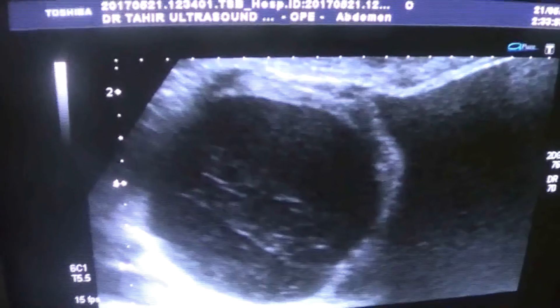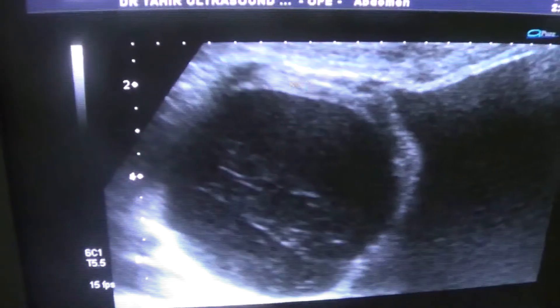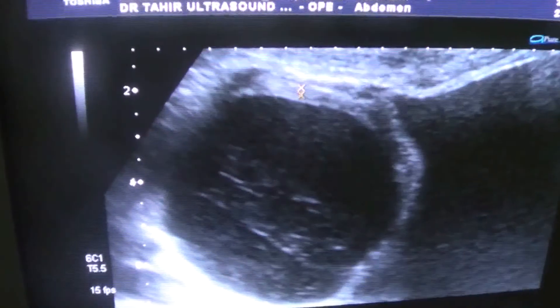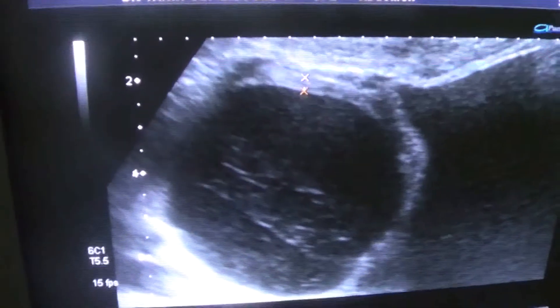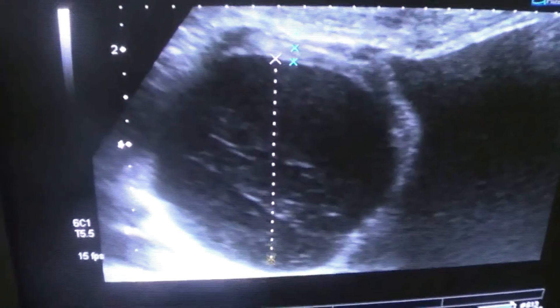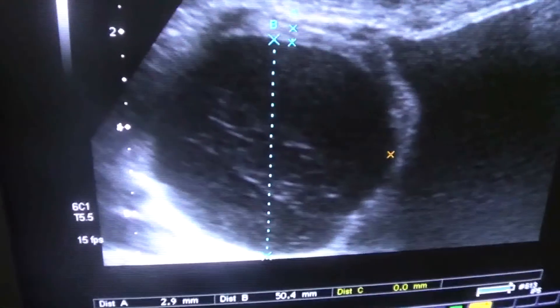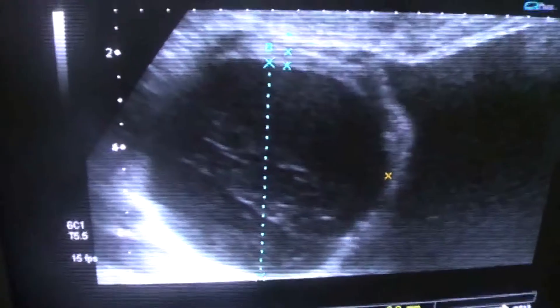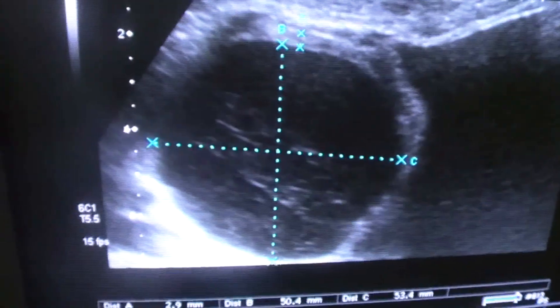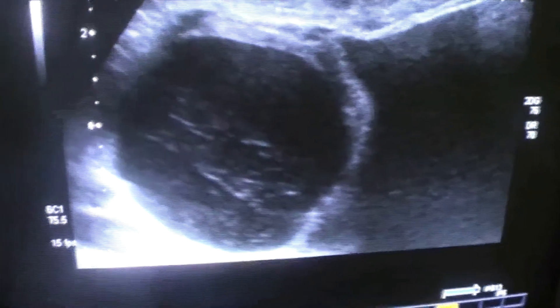This is its thick wall — the wall measures 2.9 mm. The cyst measures 50 mm by 53 mm. So this is an ovarian cyst, a hemorrhagic cyst.